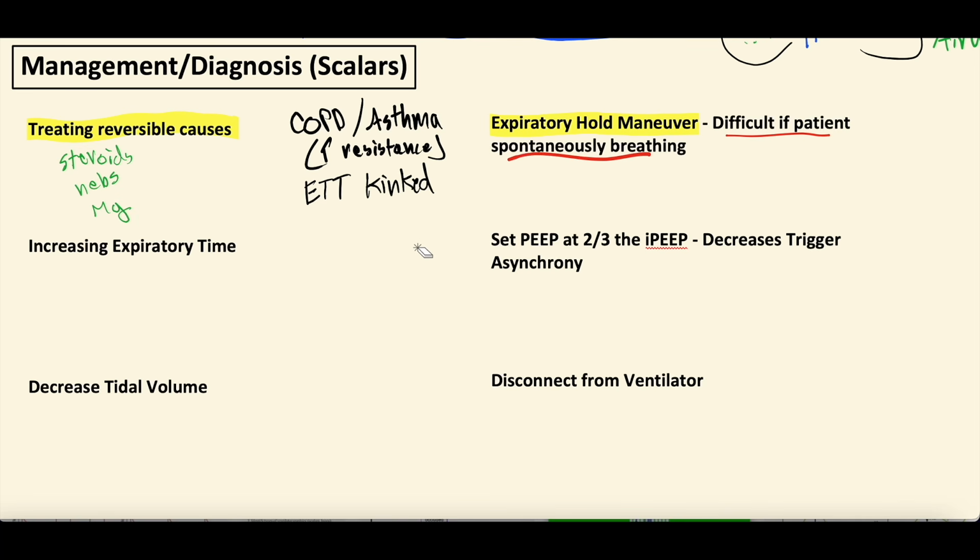That's an important one. In addition to that, sometimes we cause this ourselves, as we said, with patients that we're trying to really increase their minute ventilation. Sorry, I realized I wrote minute ventilation up here for an easier shorthand. But yes, their minute ventilation, right? Because if we set the respiratory rate way high, at 30, and their tidal volume at 500, because we're really trying to get them to breathe a ton of air. They might have an acidosis. We're trying to help them breathe off.